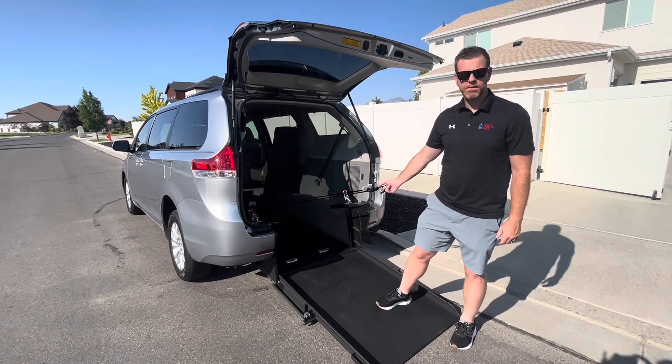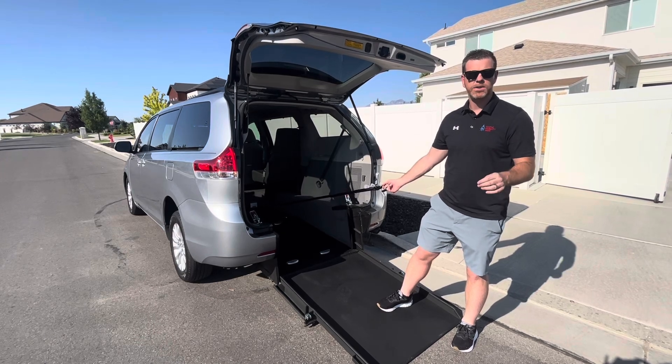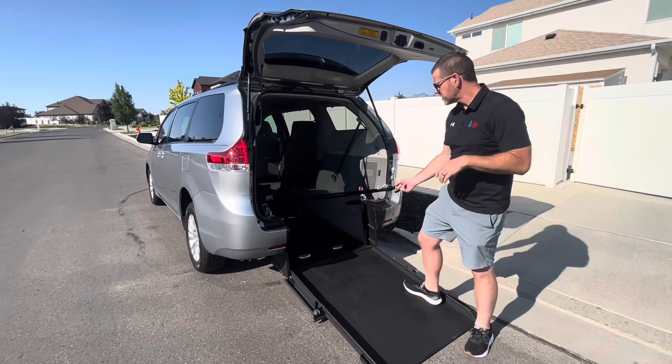Hi everybody, it's Zach with Simple Mobility Vans. I just wanted to show you another Q-Straint option that we have in our wheelchair vans that is really helpful. Come over here and I'll show you real quick.